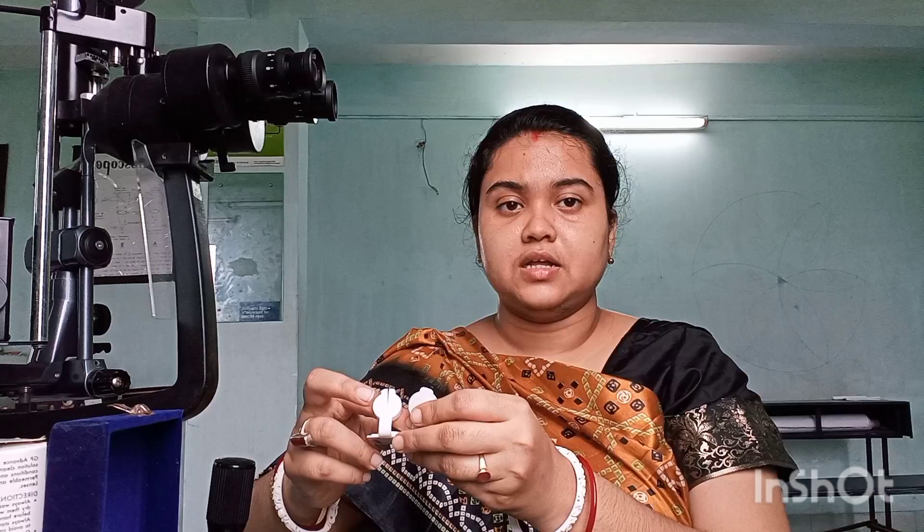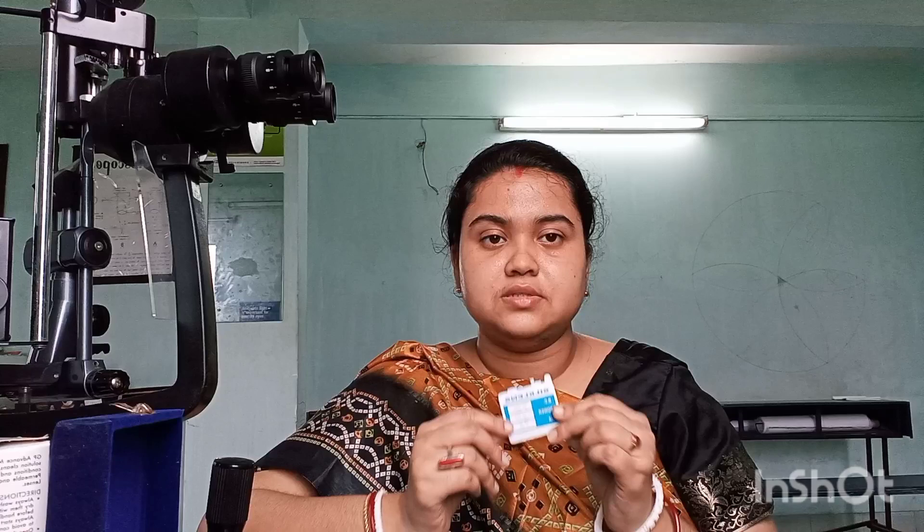To select the base curve of the contact lens, you take the keratometer reading for the patient and calculate the average. Based on that millimeter reading, you select the appropriate base curve. The diameter of the RGP lens is selected by measuring the HVID — the horizontal visible iris diameter — from limbus to limbus, using a Sharma strip or a scale.